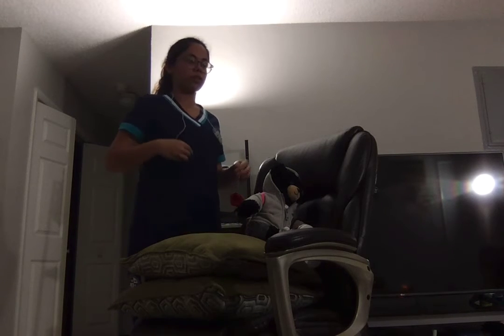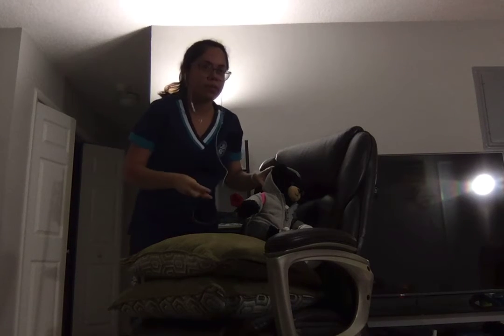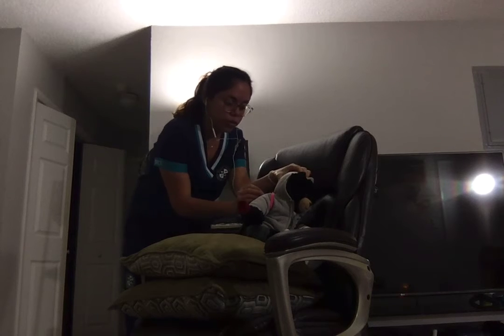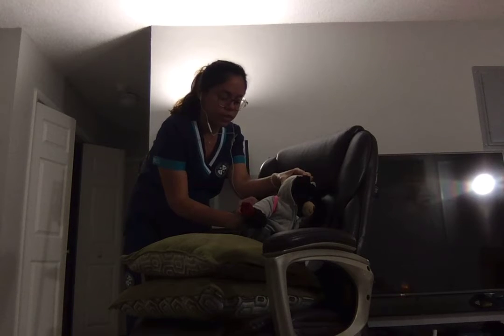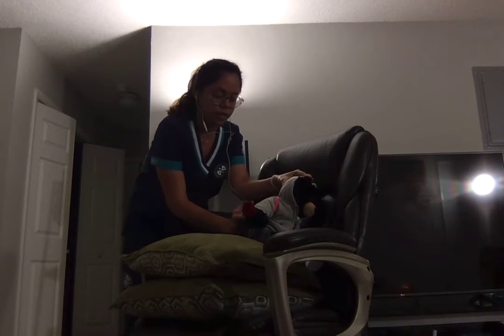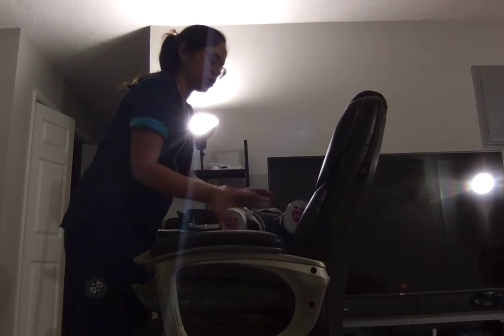Now I will also check for the lung sounds using 8 places. I will be avoiding the bone. 2, 3, 4, 5, 6, 7, 8. Okay. Now I will be asking the patient to lay down in supine position so that I can assess the abdomen.